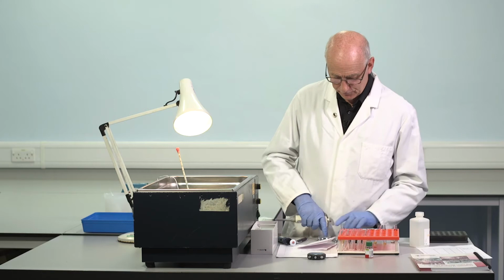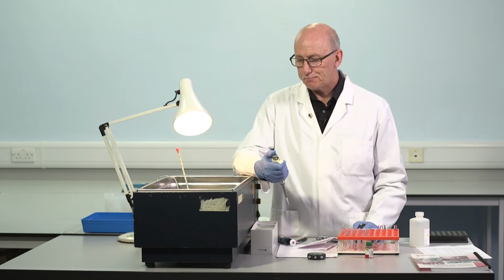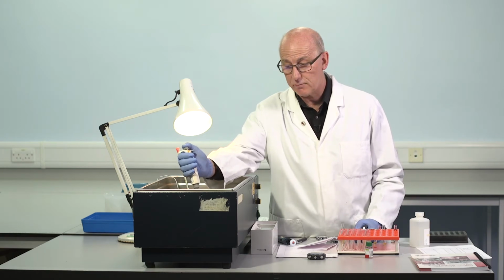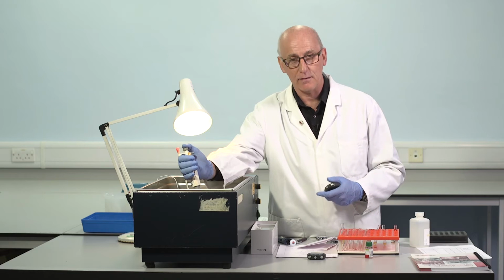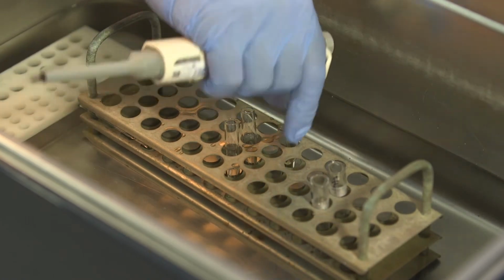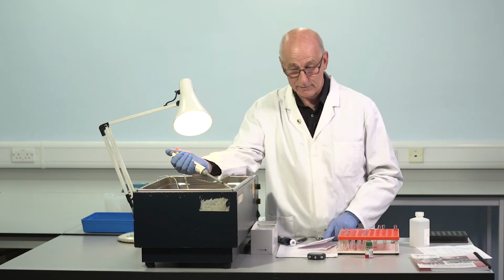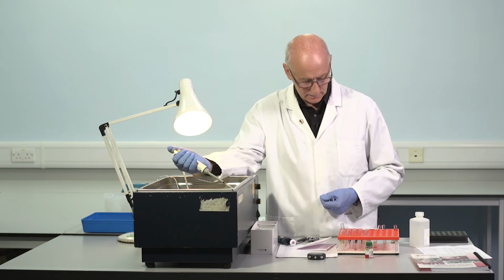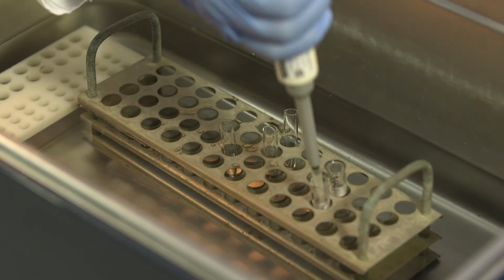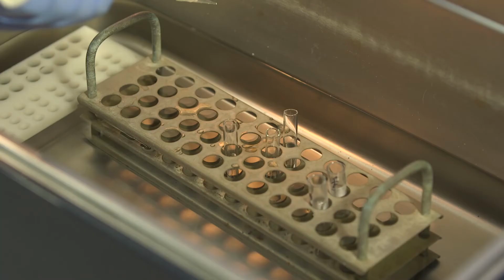So as we get to the 3 minutes, we add calcium to the tubes. And although I'm doing this just now for the purposes of demonstration with the 3 tubes having activation at the same time, it's not essential to do this. It's possible to complete the first tube, then do the second, then do the third. Scientifically, that's acceptable. This is a little faster. So at 15 seconds, second tube. And at 30 seconds, third tube.